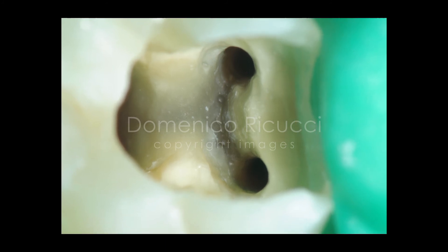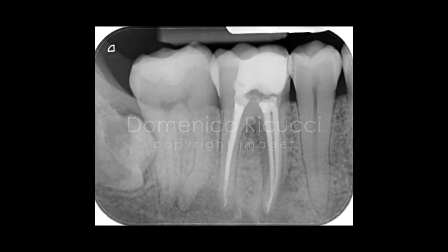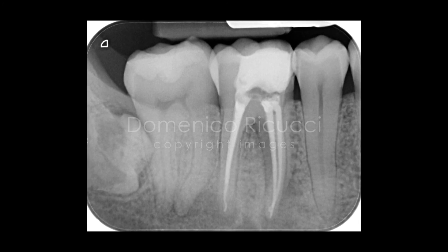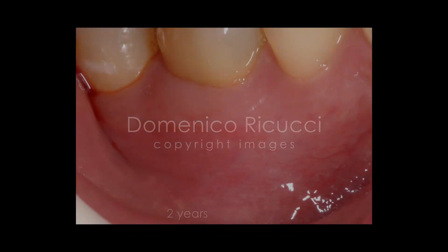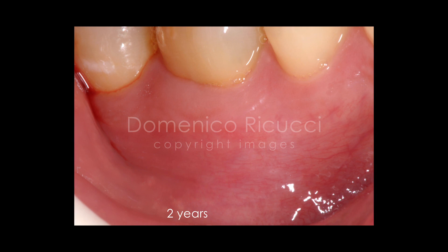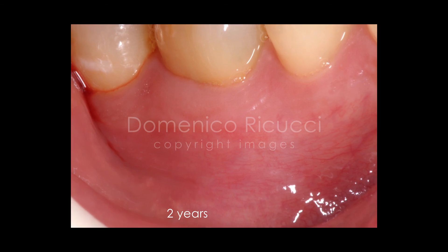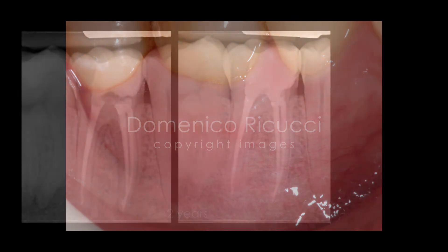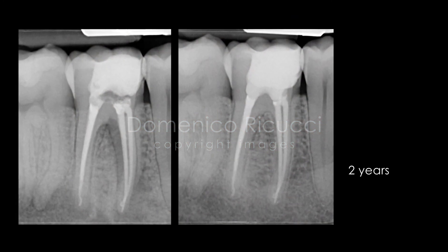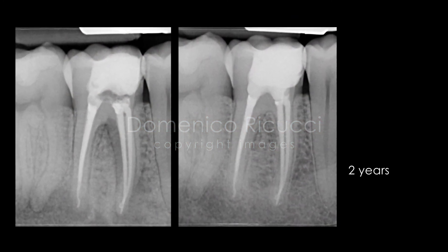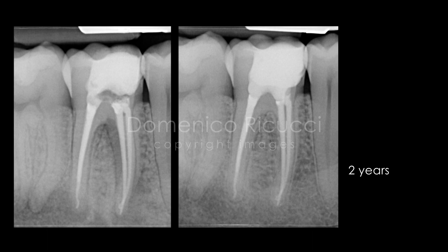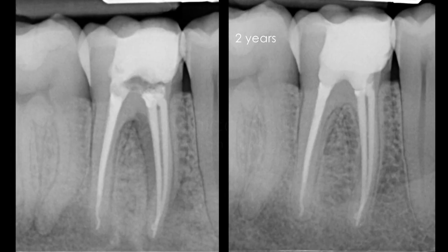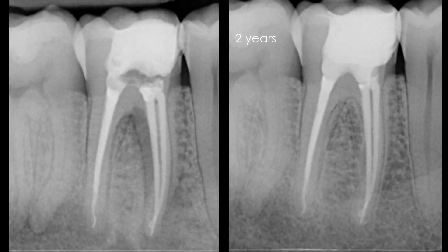The canals are finally obturated with a pre-mixed bioceramic material and single gutta-percha cones. At the two-year follow-up, the tooth is comfortable with no traces of the previous sinus tract. The radiograph shows complete interradicular and periapical healing with a continuous lamina dura along the entire root perimeter.